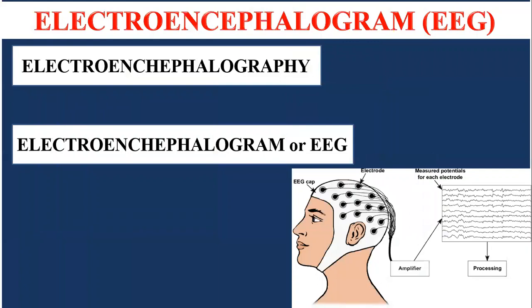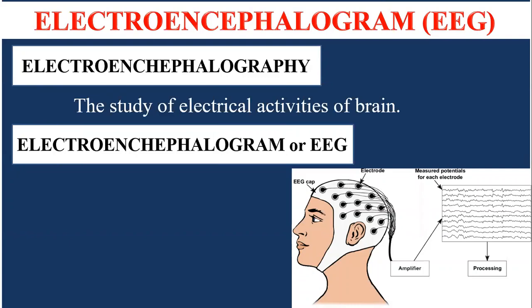Electroencephalography, or electroencephalogram, or EEG. What is electroencephalography? Electroencephalography is the study of the electrical activities of the brain.